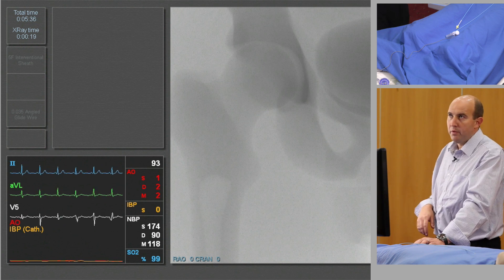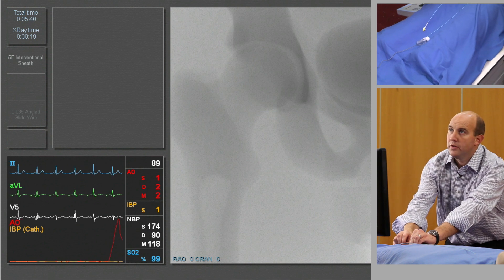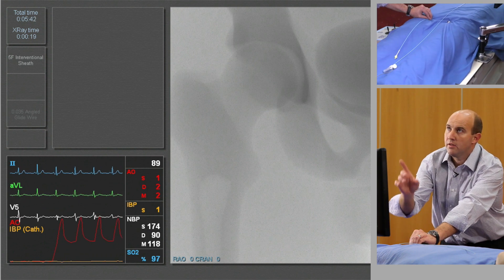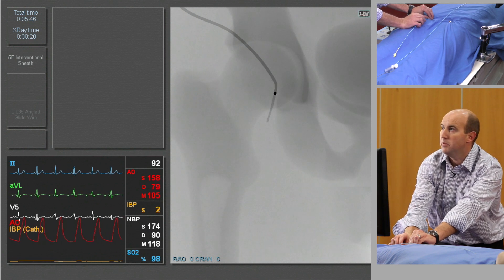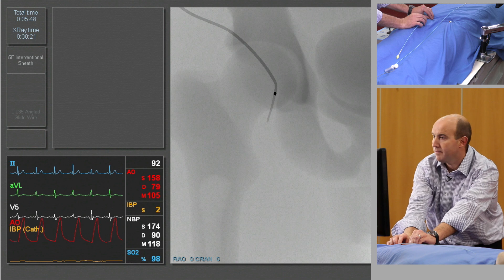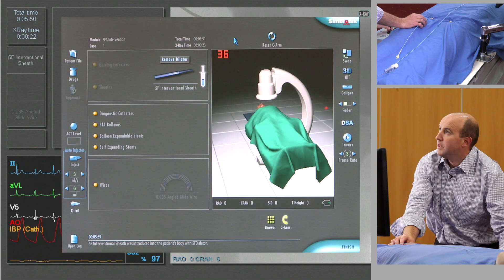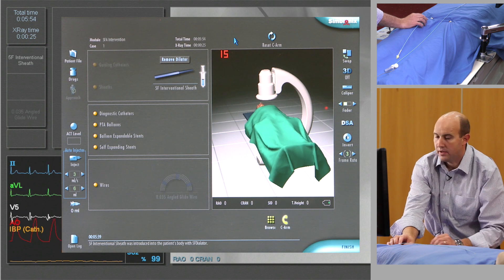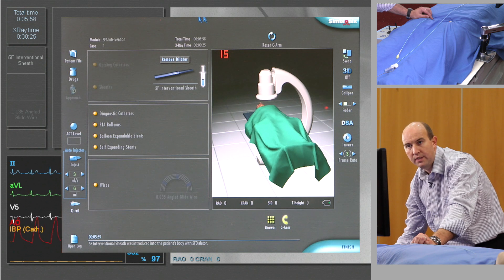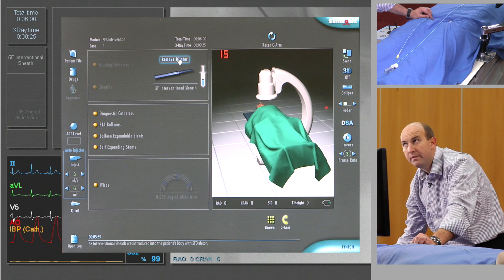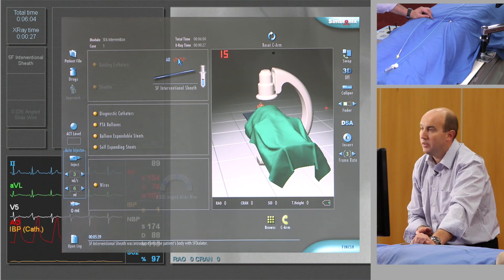We've already pre-selected the sheath — it hasn't engaged yet — so we just advance the sheath, which lights up on the large monitor as you can see. We can see the sheath in the groin. There's still an introducer in the sheath, and you have to remove that by taking out the dilator. If you look at the left-hand monitor and then screen again, the dilator is gone.